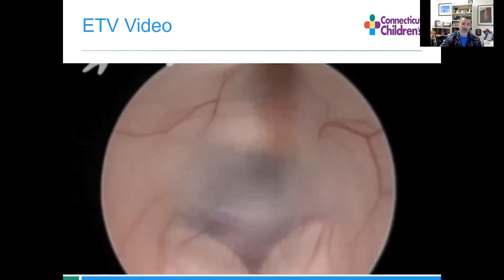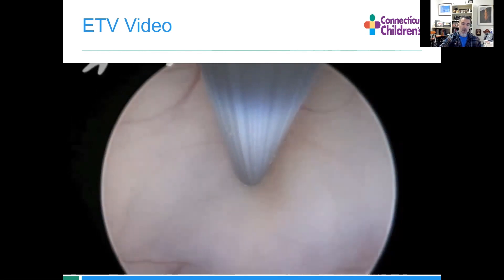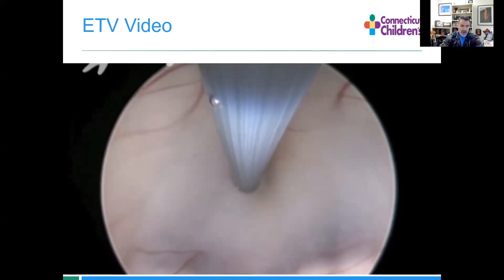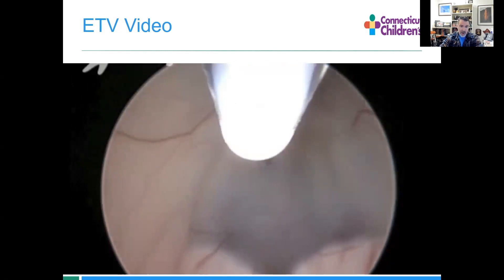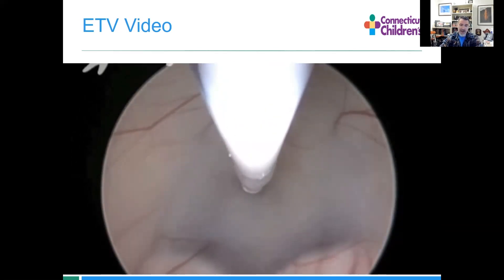Now we're coming down through the foramen of Monroe. The blush up here is the infundibular recess. That's actually the optic chiasm at the top of the screen. We're going to poke a hole through the floor of the third ventricle. Here's our poke. Now we're going to want to make that ultimately bigger, so we're going to go down through with a balloon and dilate that up.